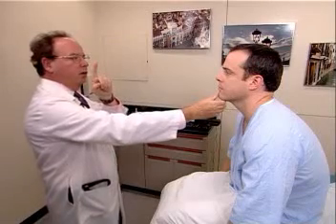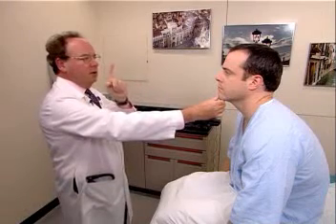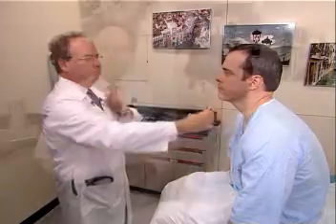David, I'd like you to watch my finger very carefully as I bring it in close. And we're now testing convergence of the eye. And we will then conclude this assessment in this position. One of the most important parts of the physical examination is the ophthalmoscopic examination, providing us with a wealth of information about the patient's health. This is the only non-invasive means of directly viewing vasculature in its native state.